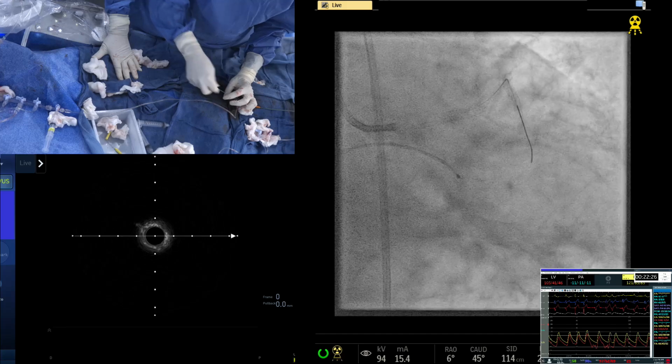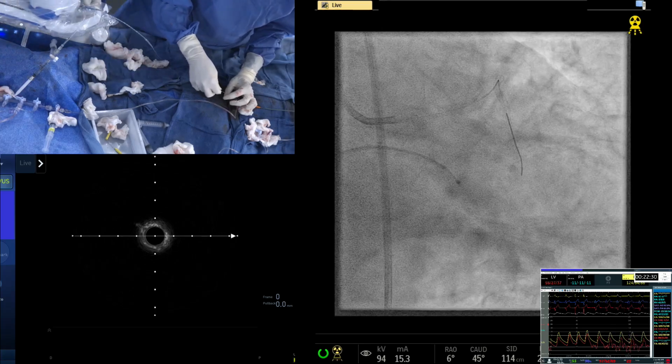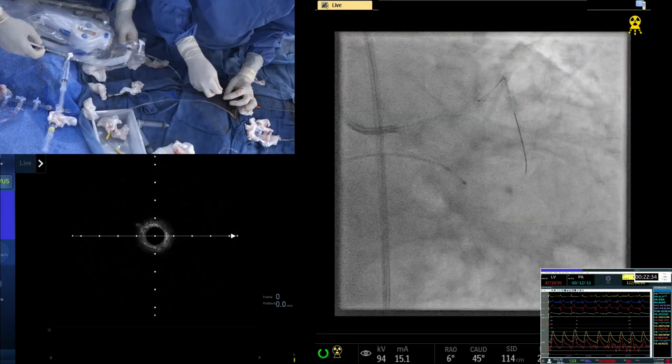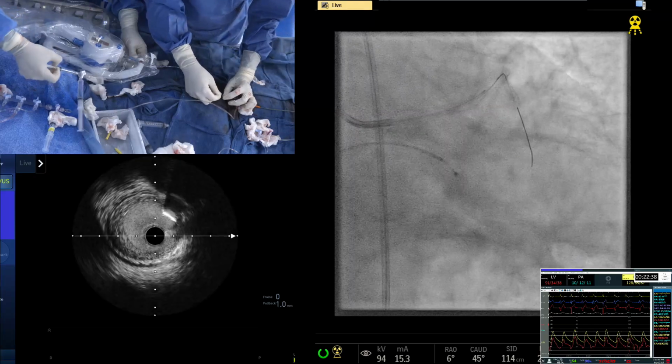But if it is a very long stent in the left main, we come from the carina back, the stent keeps on elongating while it is dilating diametrically. But in this case, probably it will not be there. But of course, okay, distal edge, let's see.